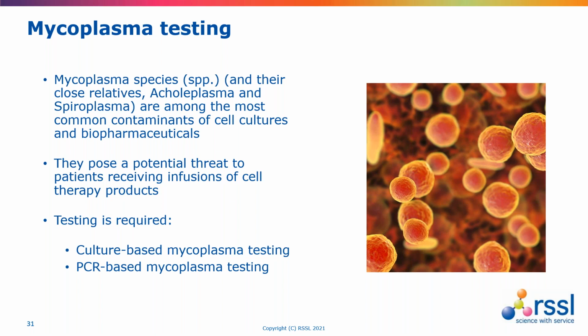So in many ways, the culture-based mycoplasma tests are not necessarily going to fit very well in the production of these next generation products where there might be an urgent need to produce something for a very ill patient.